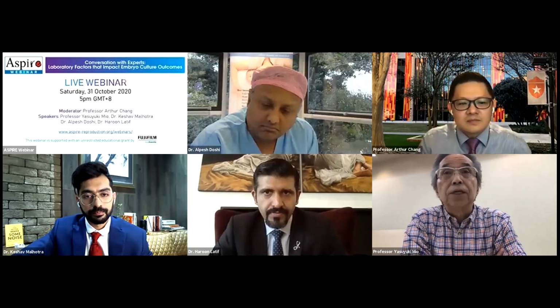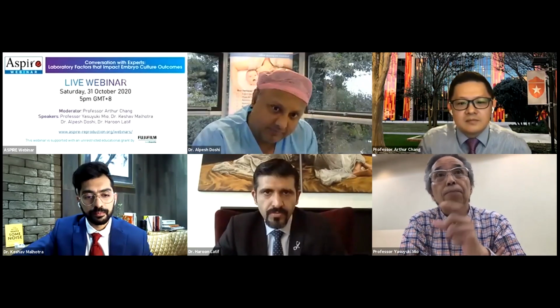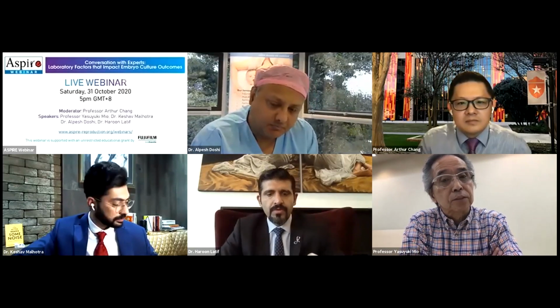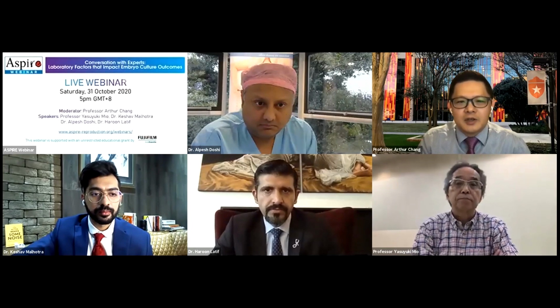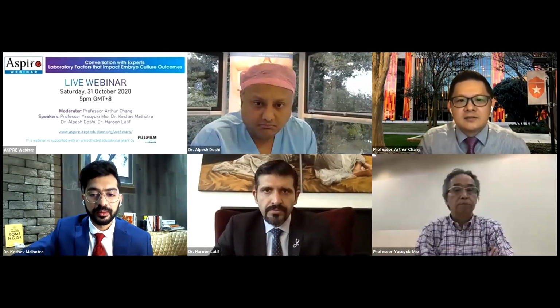Yes, I recommend that within 1 week, you should use the 1 bottle of the culture media. Within a week. So we use a smaller bottle, instead of using the big bottles. Yeah, 10 ml bottles.